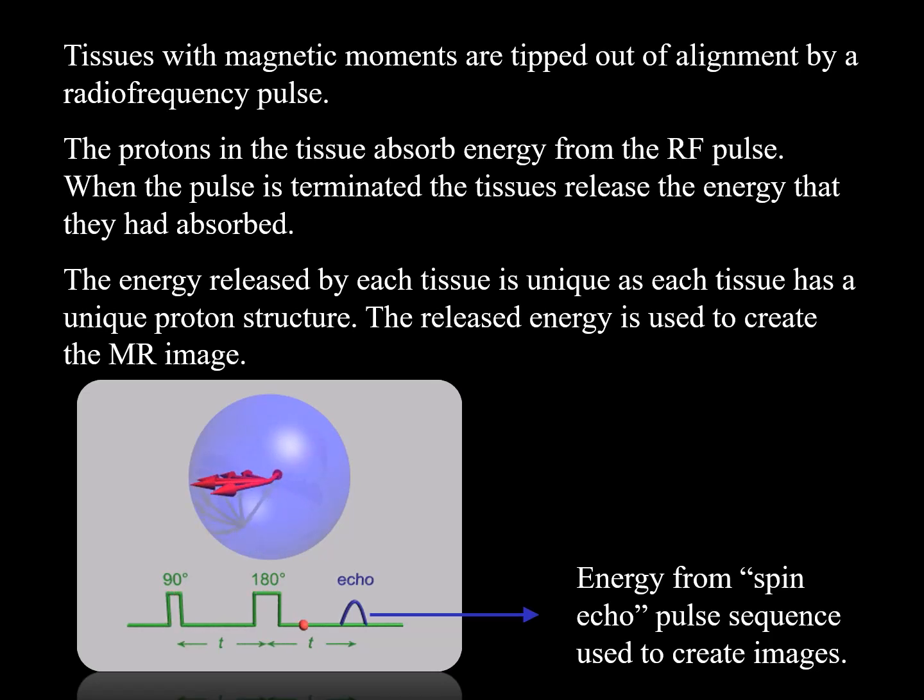A simplistic analogy would be when you did an X-ray and the tissue absorbed the energy, the amount of energy absorbed was related to the tissue it went through. The ionizing radiation that penetrated the patient was then utilized to create an image. Just as the strength of each of the tissues' released energy creates an image in MR.